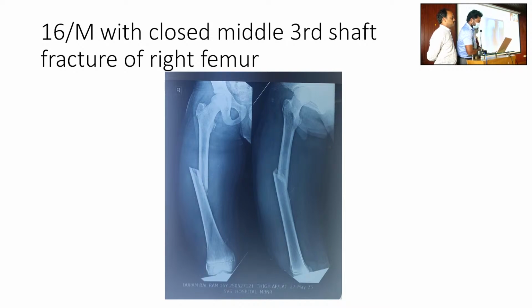How? Where is the entry point there? As medial as possible. It is an interlocking nail, it has to go only through the piriform fossa. Yes, or the tip of the trochanter, special plates or special rods are there, but not available here. But we have injured that now.